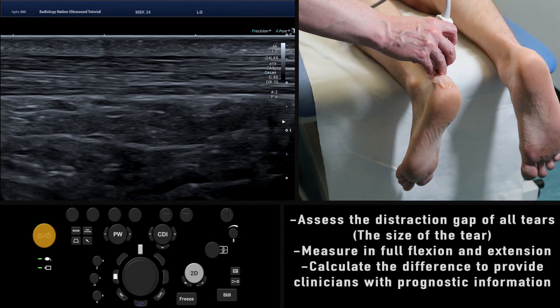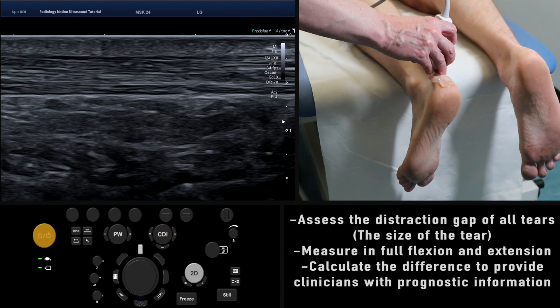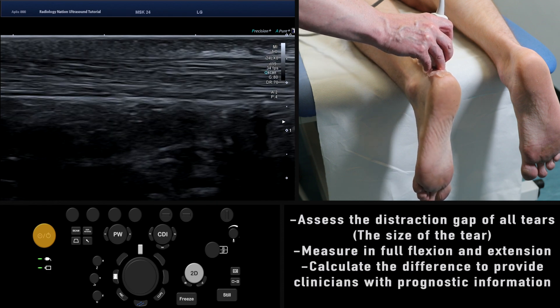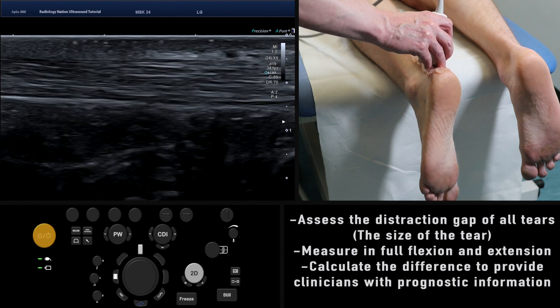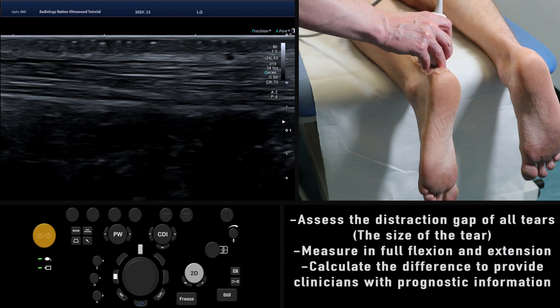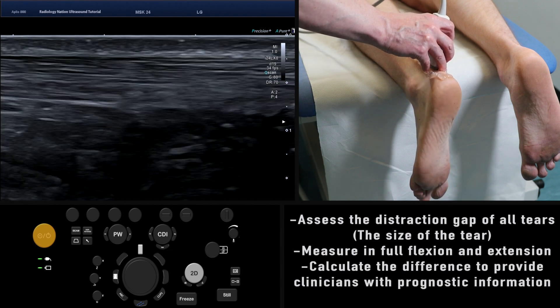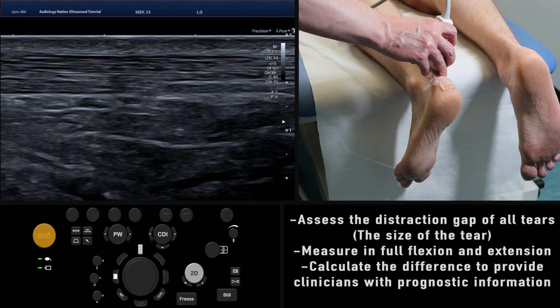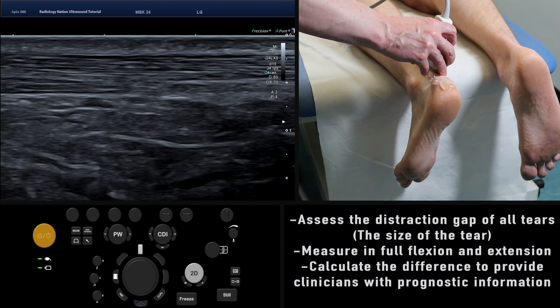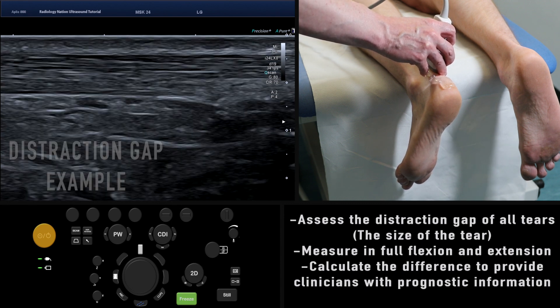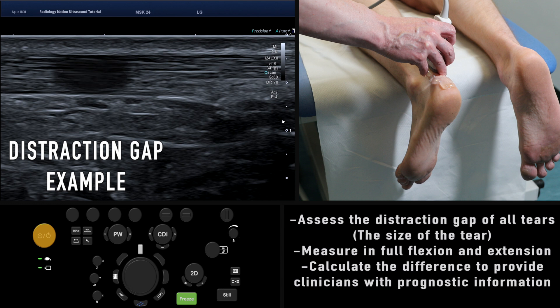If a tear is seen, the final stage of the procedure is to assess the distraction gap. Measure the longitudinal distance of the tear in both full extension and flexion of the ankle. The difference between the measurements is the distraction gap and will give a clinician valuable prognostic information.